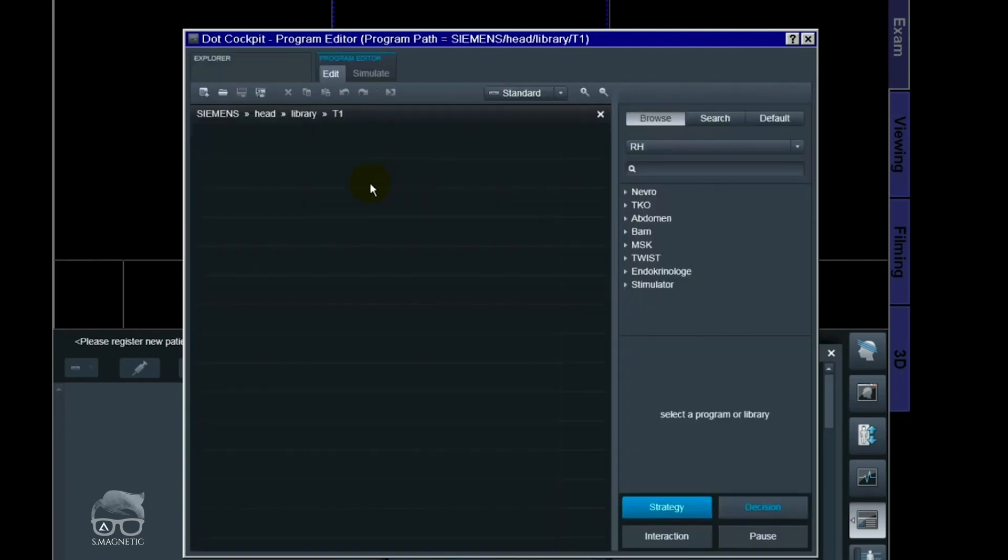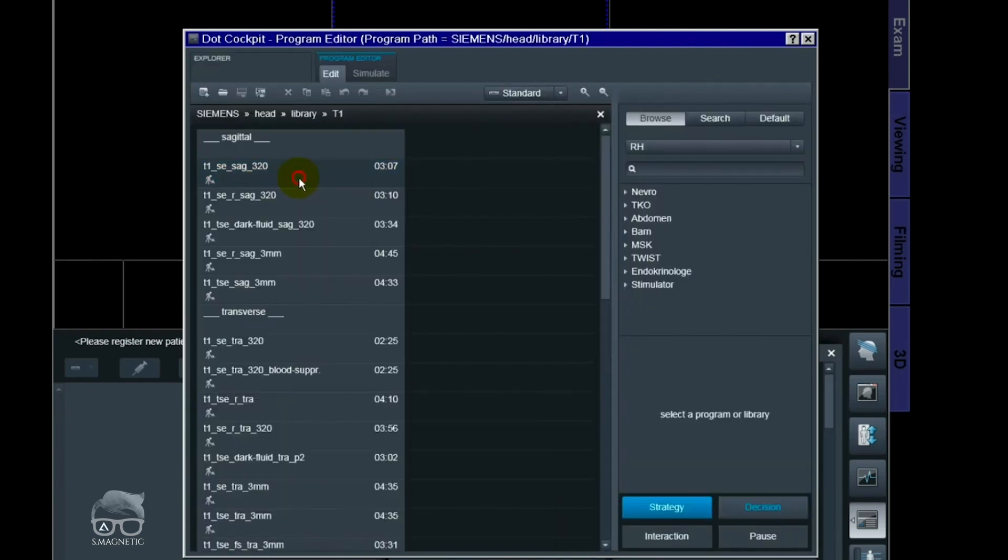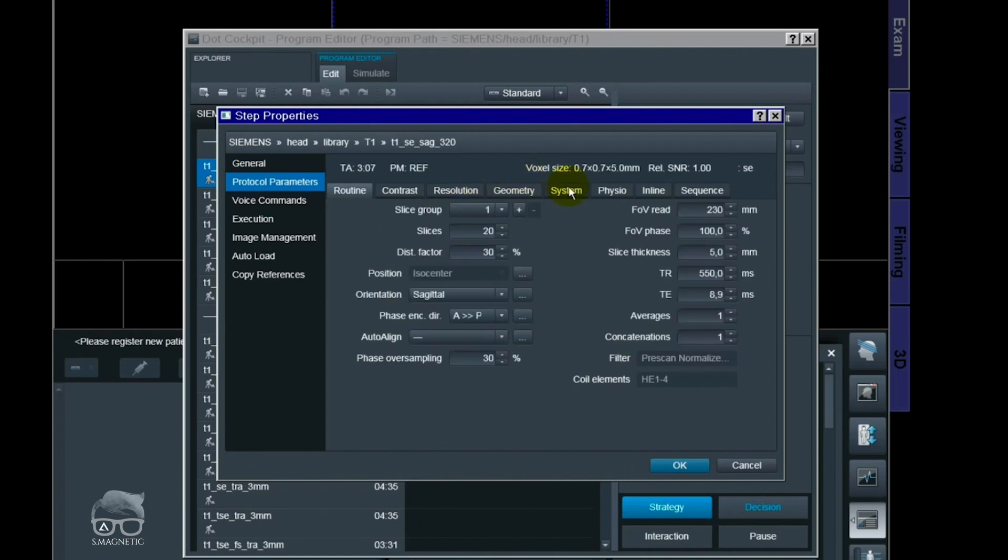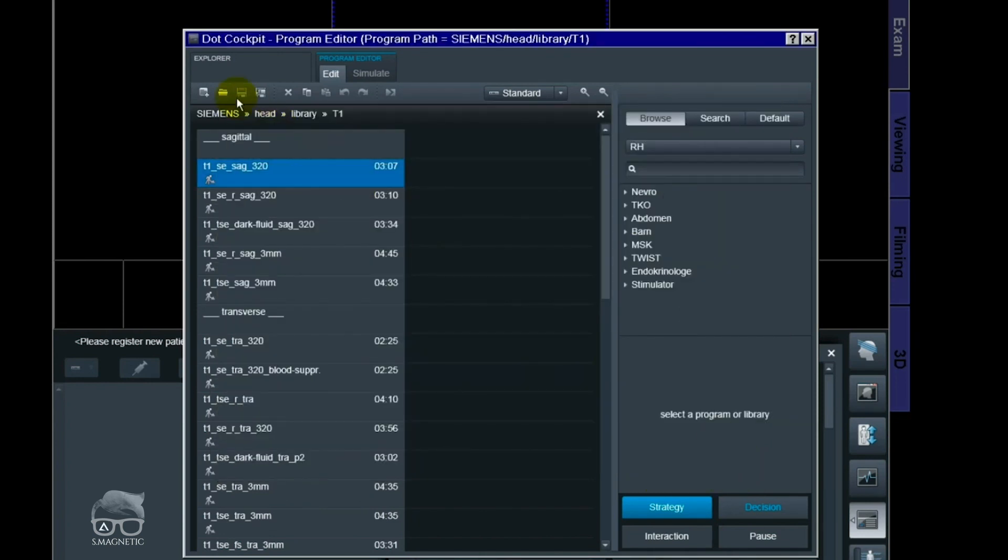Here you have the opportunity to edit your protocol in edit mode and save it if you want to.